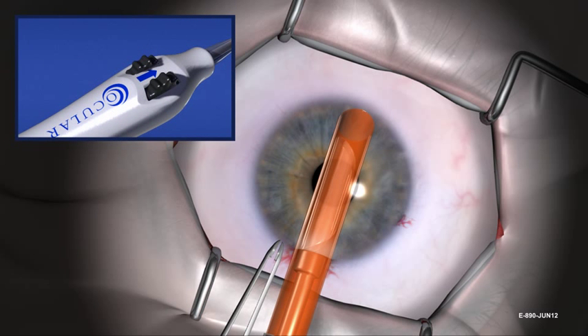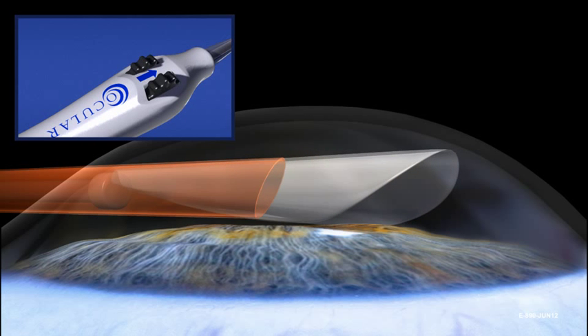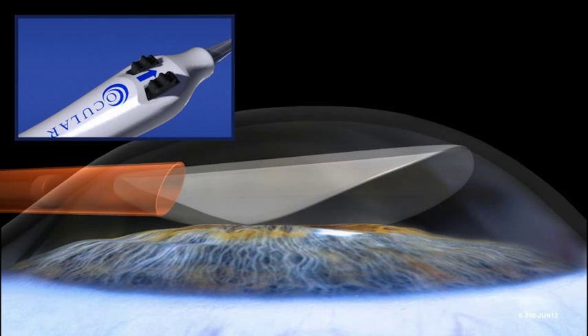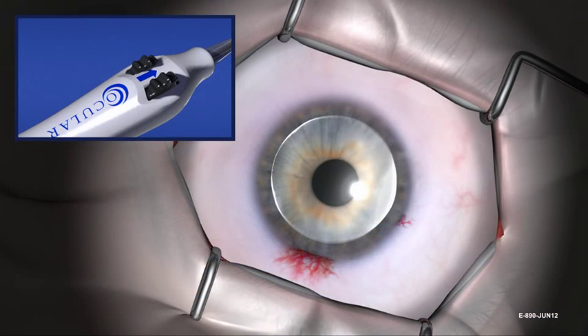Deploy the allograft by rotating the black deployment wheels forward towards the patient and rotating the EndoSaver 45 degrees to the right as the graft is exposed. Roll the black deployment wheels until the allograft is completely uncovered. The EndoSaver uncovers the tissue allograft and the sheath will retract towards the incision during deployment. Hold the device in position as the allograft deploys. After the allograft has deployed, hold the black deployment wheels in their position and remove the device from the anterior chamber.